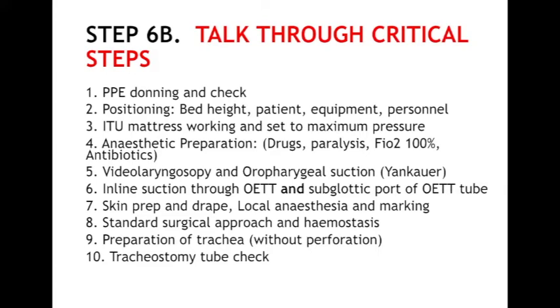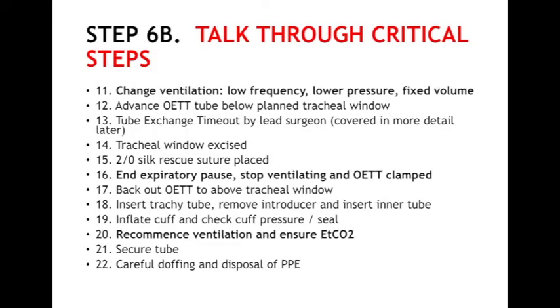Once the trachea has been prepared without perforation, a short pause in the procedure is recommended to ensure coordination between the anaesthetist and surgical staff. Following this pause, the ventilation strategy of the patient may be changed to a lower frequency, lower pressure ventilation with the ventilator set to a fixed volume.